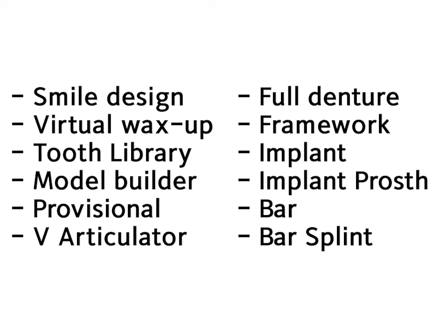Subsequently, there is a bite splint module. It is possible to design Michigan or other types of splints and mouth guards with CAD software. Some software allows synchronization with the virtual articulator module in order to adjust the occlusion of the splint with the antagonist arch and optimize the final design.